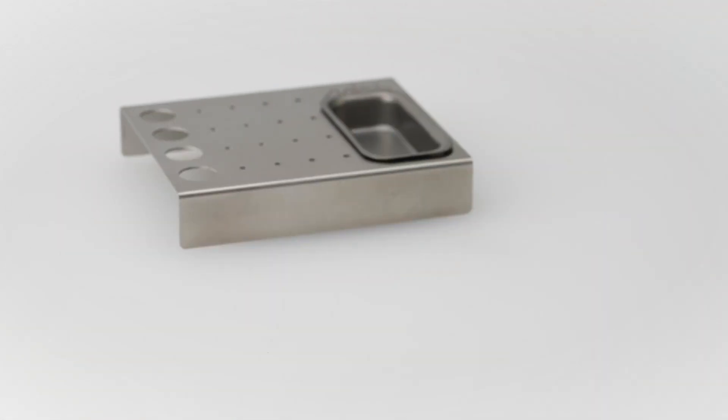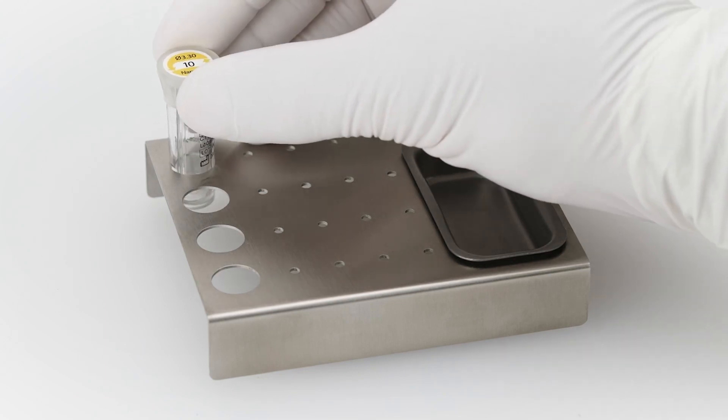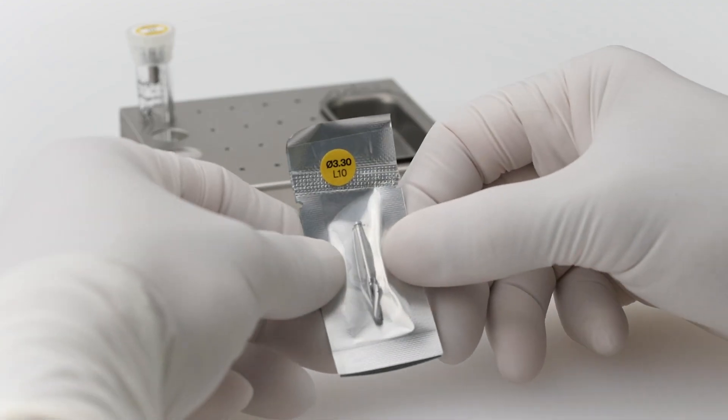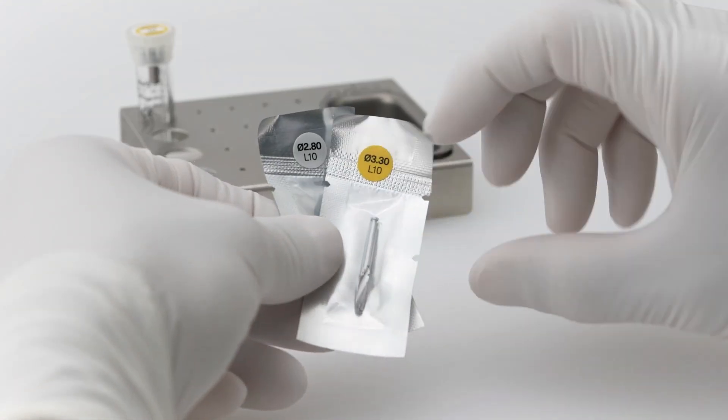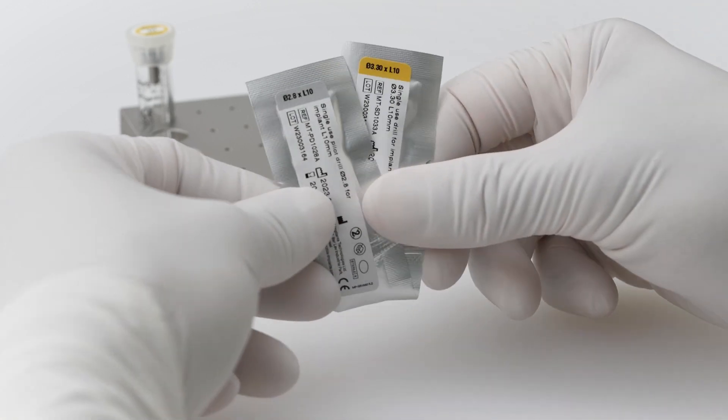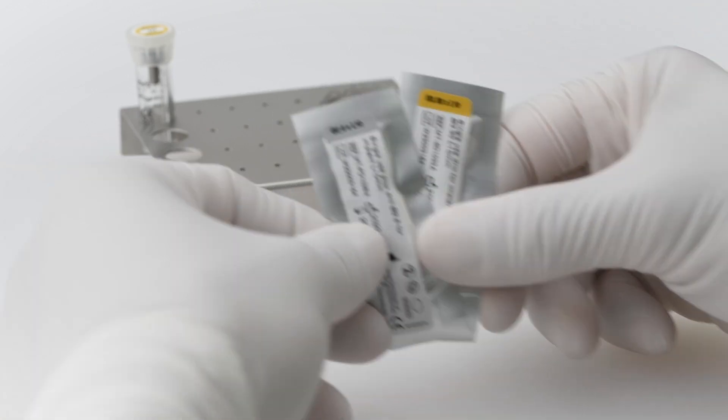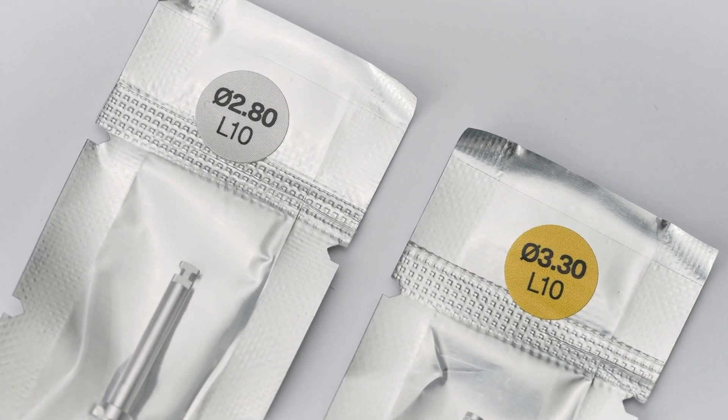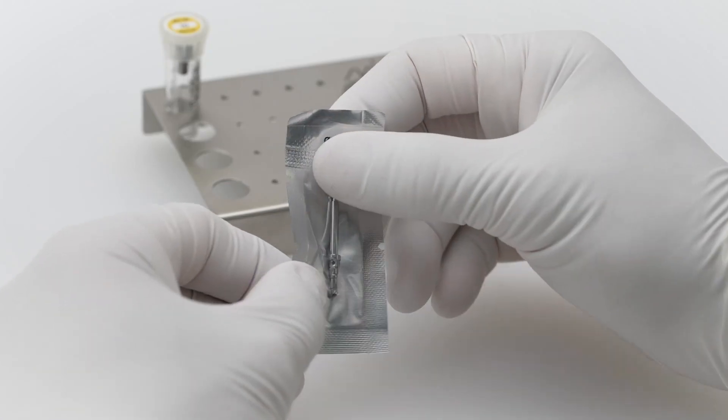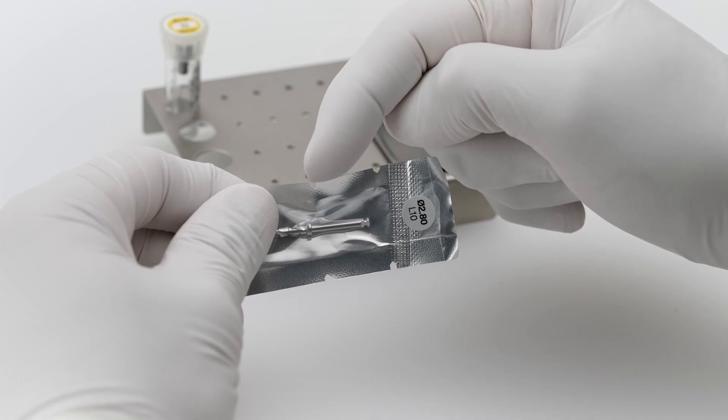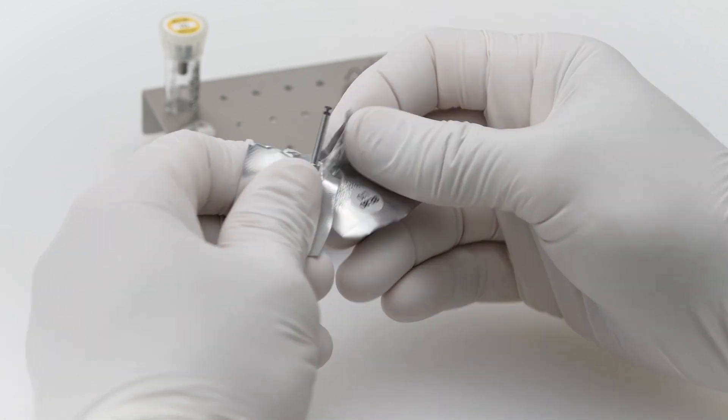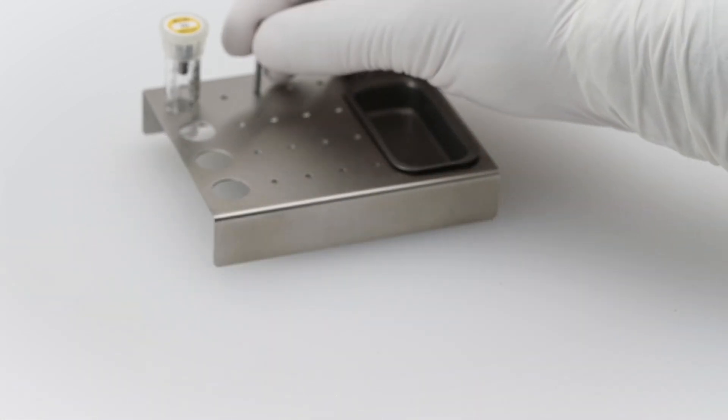Open the implant package and place the inner tube on the organizer tray. XD drills are provided in a sterile color-coded pouch for easy identification. In accordance with the drilling procedure and consistent with the existing MIS color-coding, carefully open the sterile pouch and place each drill in the tray next to the corresponding implant according to the procedure workflow.